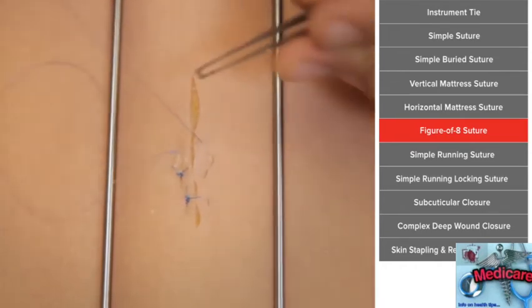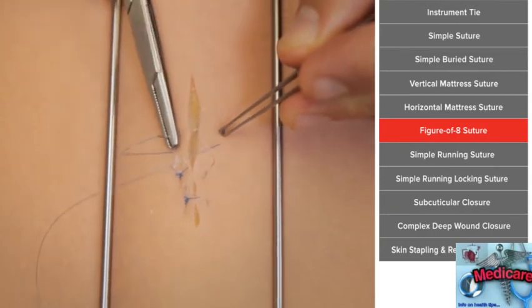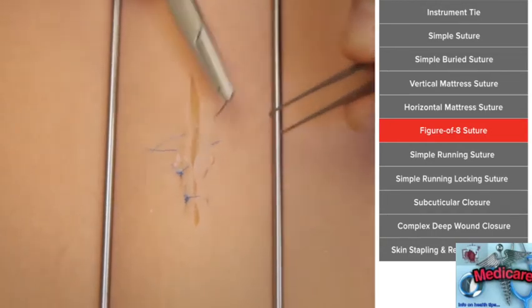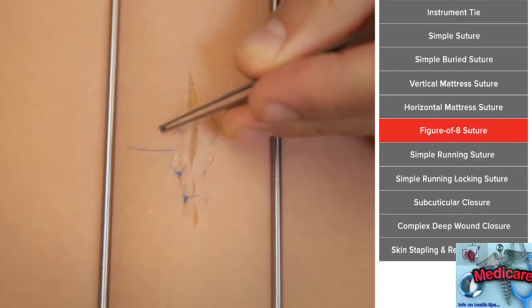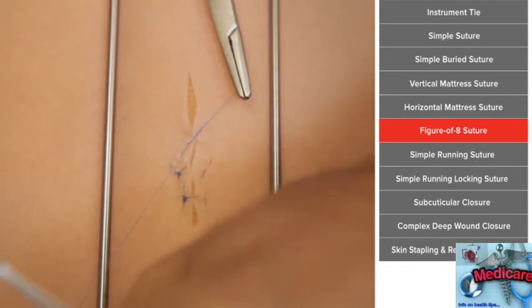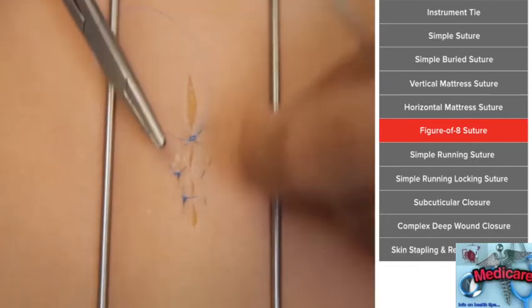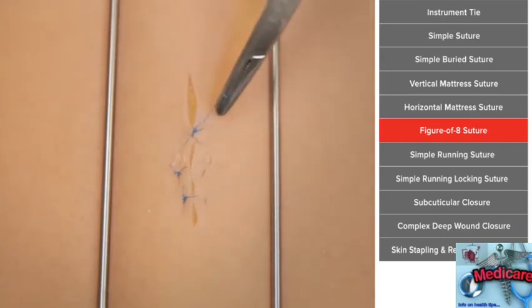We do simple suturing and simple suturing, except this time, rather than turning the needle around, we simply move along and take another simple bite. So same distance, same spread, except now, because we didn't turn the needle around, we have suture crossing in the middle. And as we tie it, you can see it looks like an 8, hence the term figure of 8.